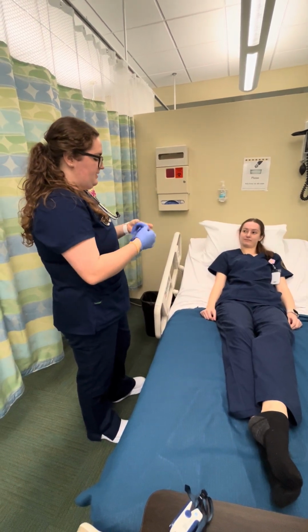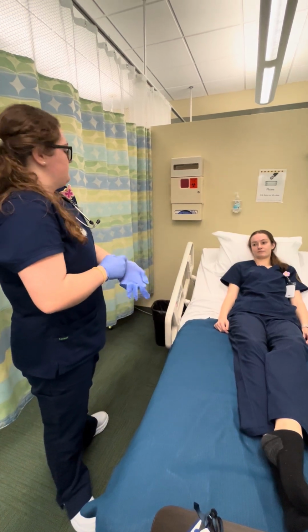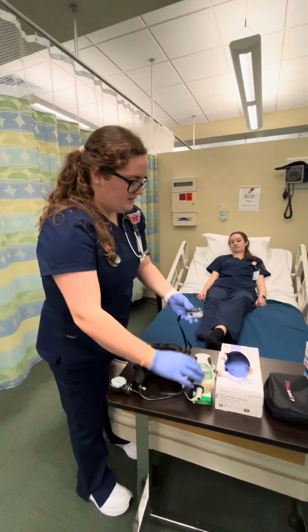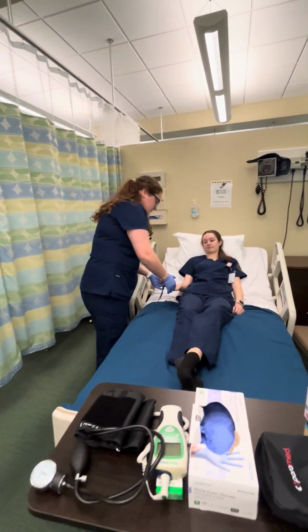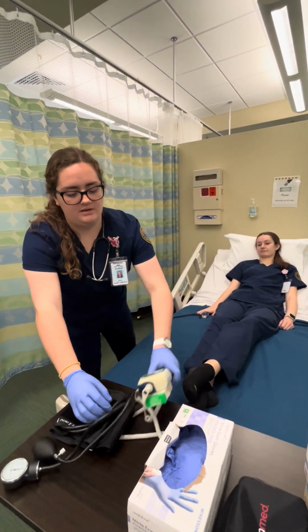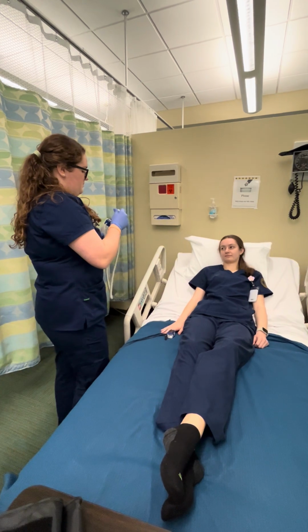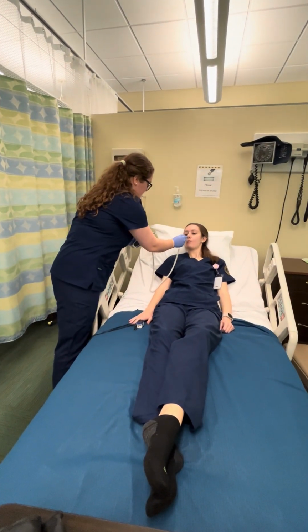Okay. Once I get my gloves on. Okay. I'm going to start with getting your O2 saturation. And while that's going on, I'm going to also take your temperature. While you open your mouth, and put this under your tongue.